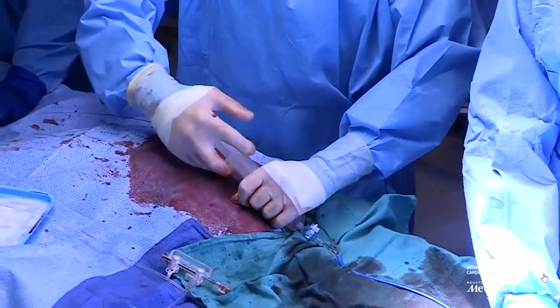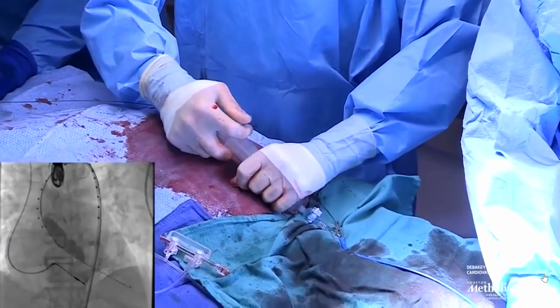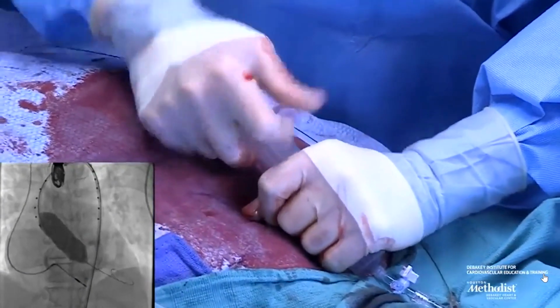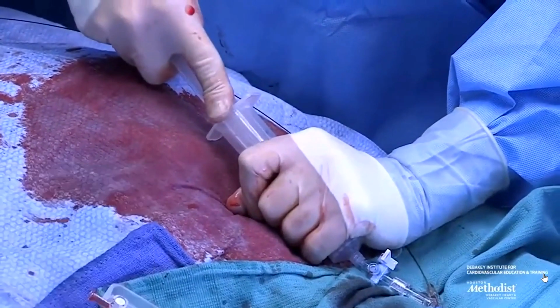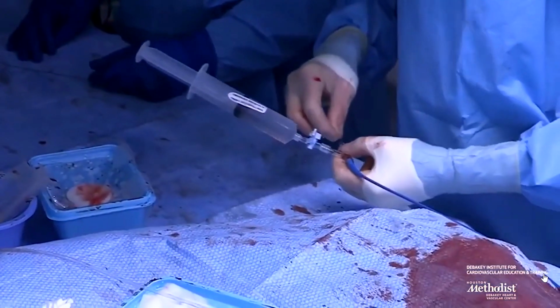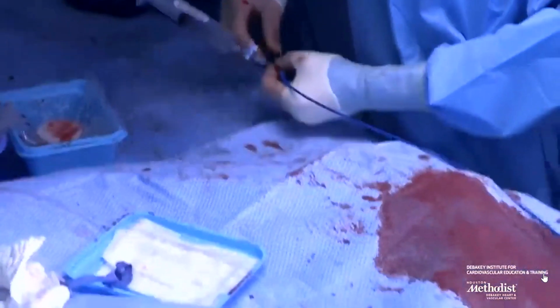We pace the heart really fast to 180 beats per minute so that it allows us to inflate that balloon. You can see in the corner that balloon being inflated across the valve, and then you deflate it completely. That helps push some of the calcium that's in the valve towards the edges of the aorta. And then over that wire, you pull back that balloon.